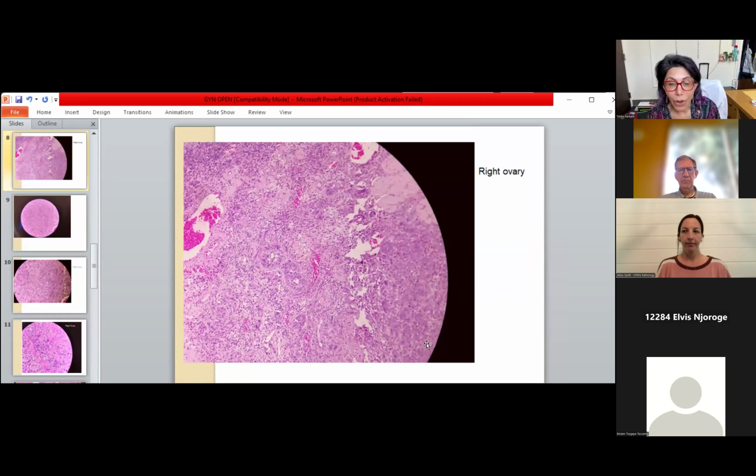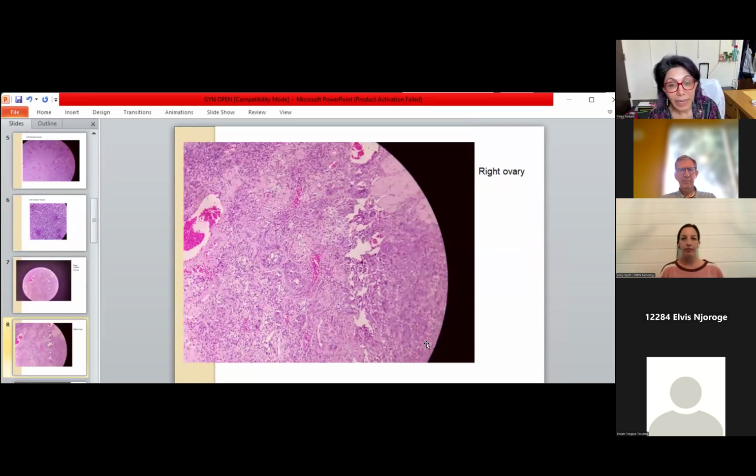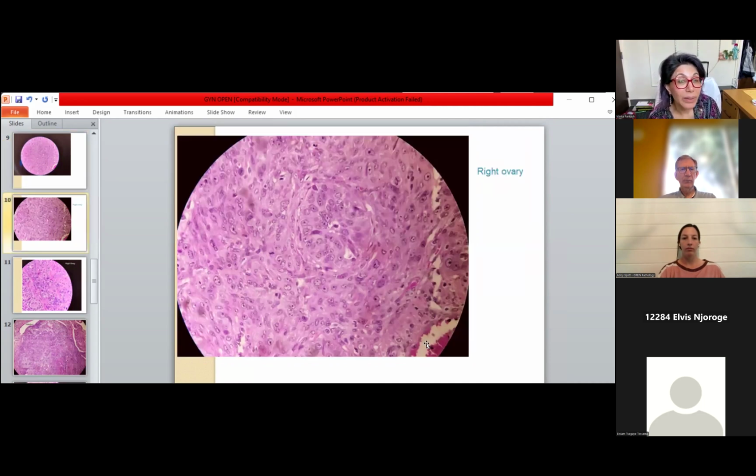This is a non-GYN, a metastatic carcinoma to the ovary and probably non-GYN. I would think it doesn't look colonic to me, so I would be thinking pancreaticobiliary, a pancreatic type tumor. I don't really know where the primary is, but here we would do immunohistochemical stains to see if we can characterize the malignant tumor better. I think that's pretty much all that I have to say, Lewis.